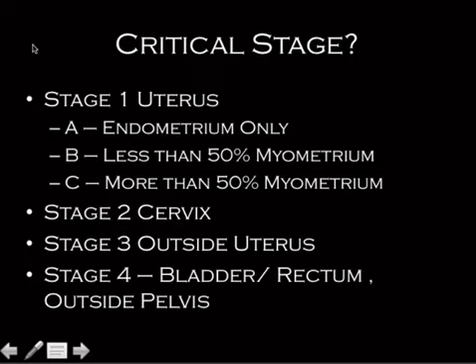And I think the most likely question is any time that it's going to change therapy, it's going to change the surgical approach, it's going to change whether or not they get radiation, or any kind of a change to management, and it's something that the radiologist can actually tell. That would be what I would consider a critical stage, and I would think that that's the thing that you need to know. So in this case, myometrial involvement more than 50%.